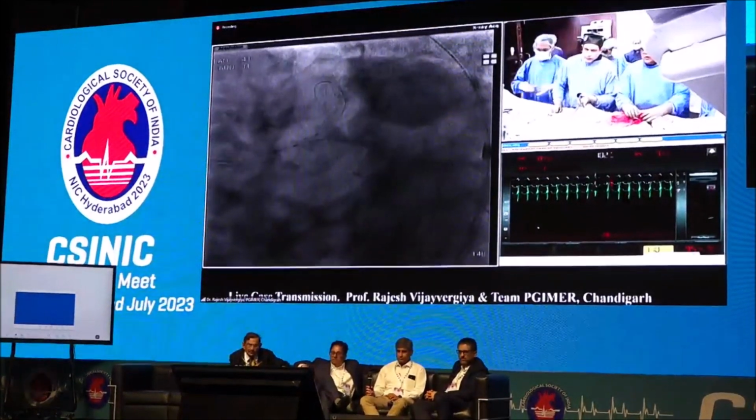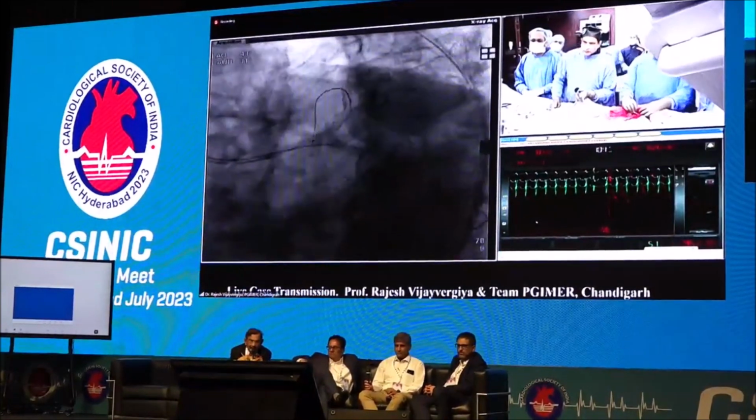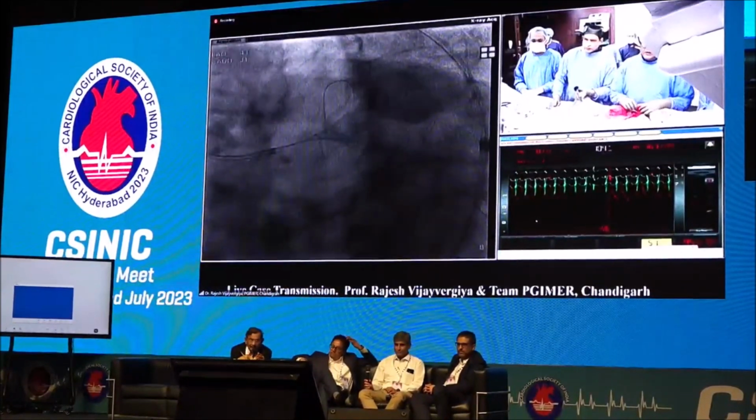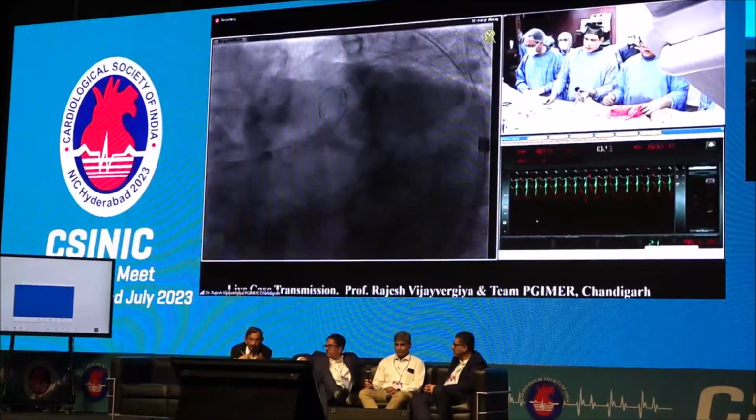in case our balloon is going to hang in the aorta. That's what. So, Dr. Rajesh, on this side of the room, you have actually done the kissing balloon, the circumflex and the LAD after the DEB implantation. But the question is that the effect of the drug will be lost in the circumflex.